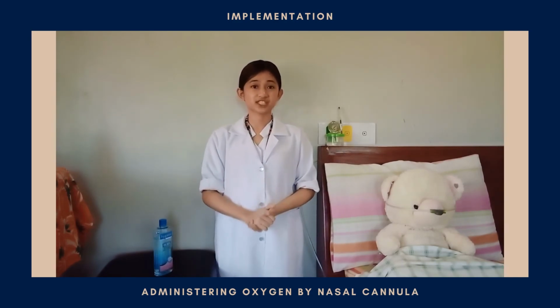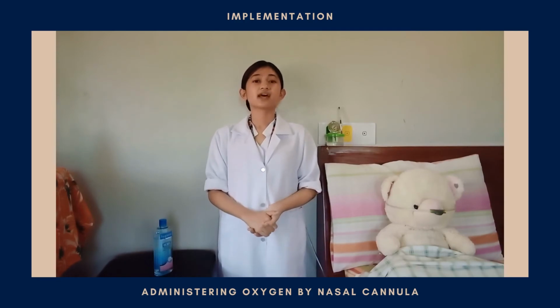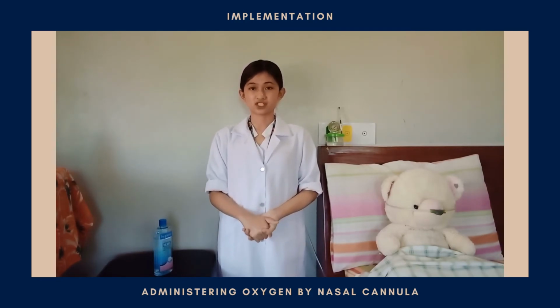Then, document the procedures done on the patient, the oxygen device used, the flow rate, the patient assessment, the physical assessment, and the time that the oxygen was administered.